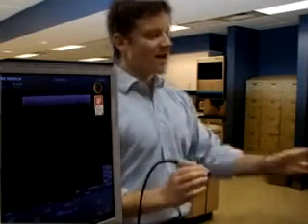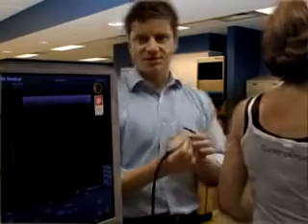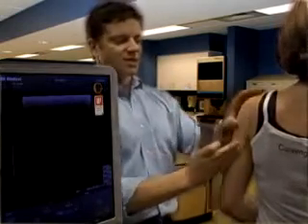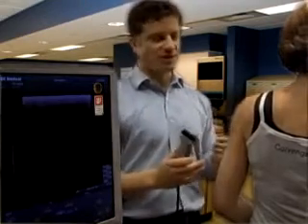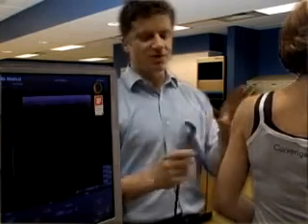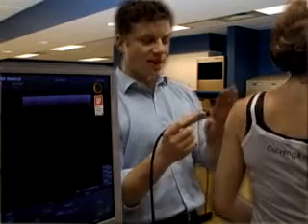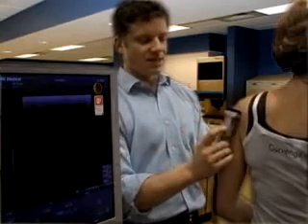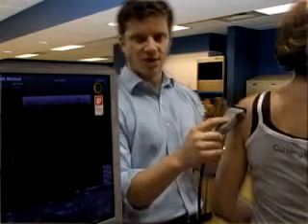I'm going to take my model here and bring her in so that you can see the composition of the transducer and the corresponding ultrasound image. The glenohumeral joint — this is going to be in the posterior. This is not the anterior approach. That approach is also possible, although it's less favorable than the posterior, and that's the one we're going to focus on today. I'm going to lay the transducer across the humeral head in the transverse view.